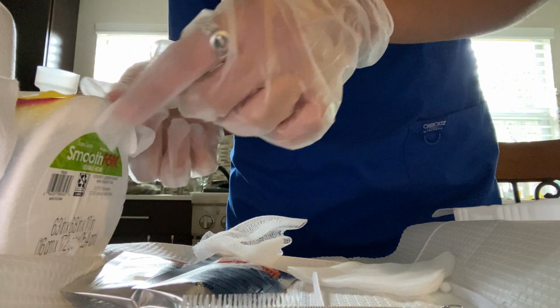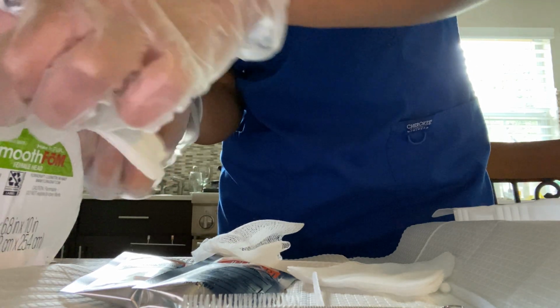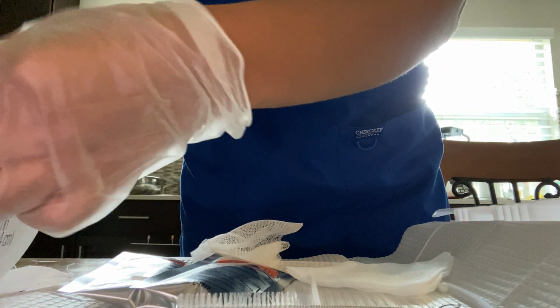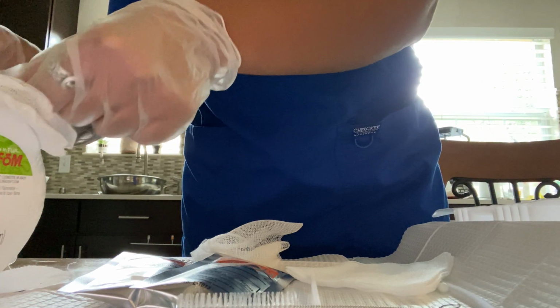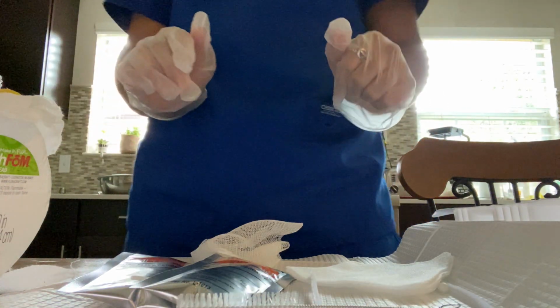Okay, maintaining sterility, everything's clean. You finished your sterile part. So now you're just going to put the final dressing on. All right, final dressing is on. Sorry, my head is squeaky. Okay, final dressing is on.